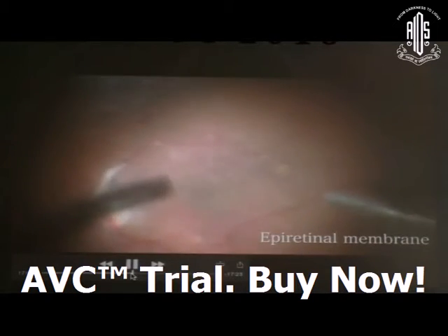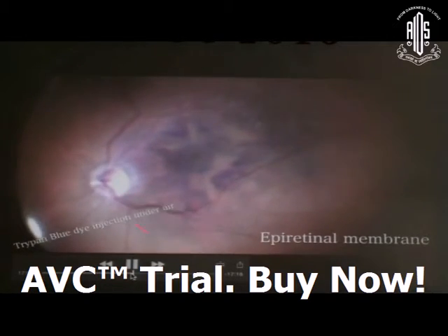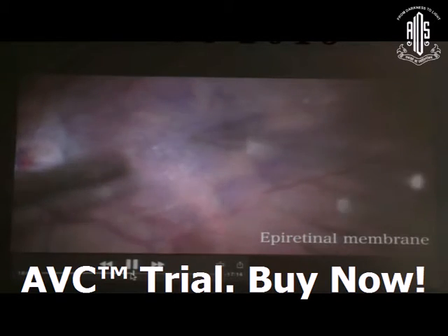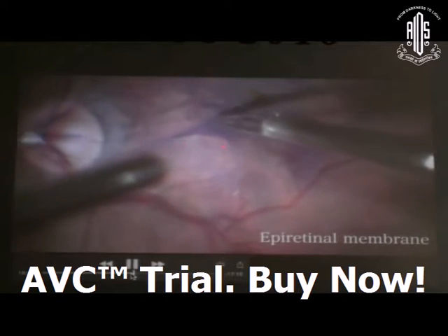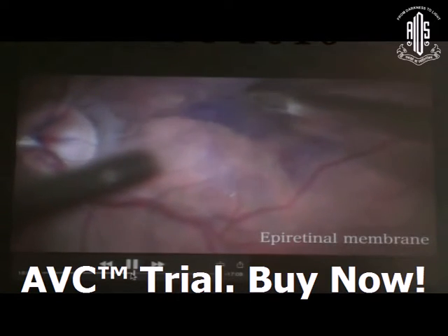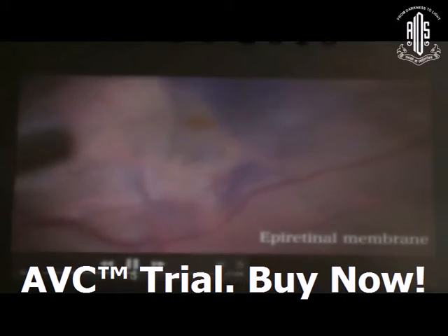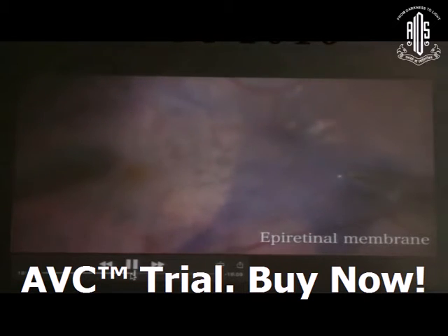Now moving to macular surgery. First is epiretinal membrane. After proper vitrectomy, stain the epiretinal membrane with trypan blue, injected under air. The most prominent and thickened area of the ERM should be picked up and peeled from the retinal surface.